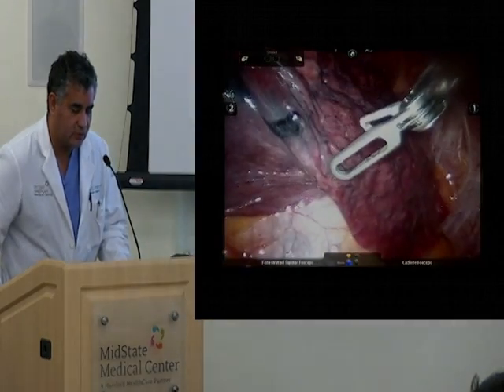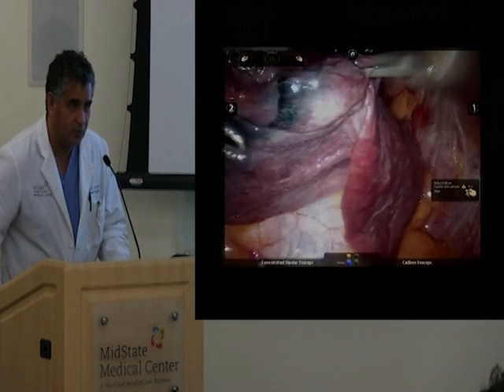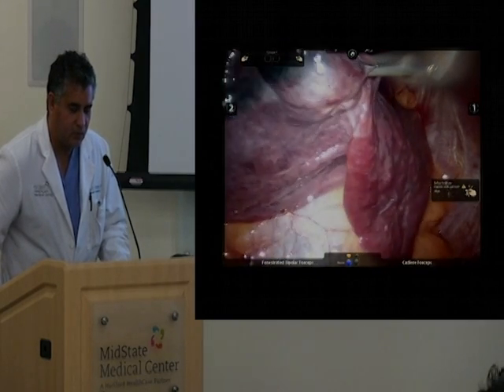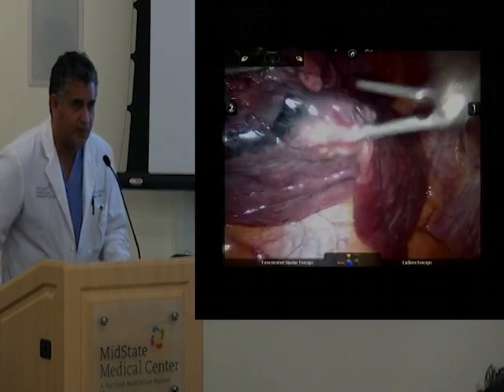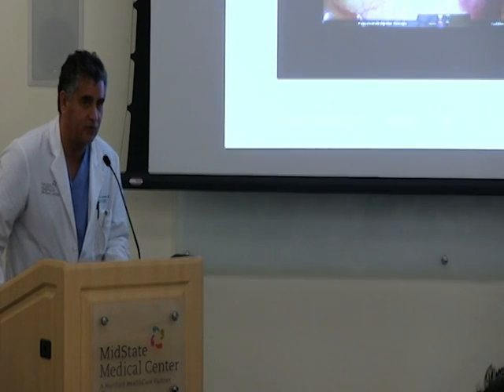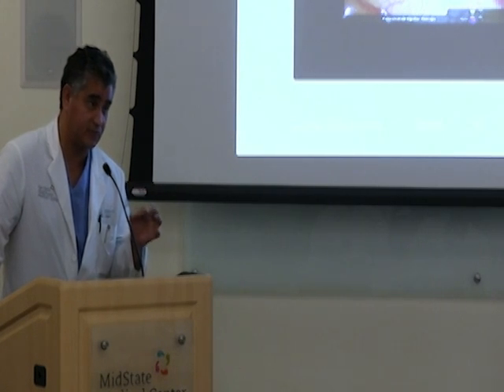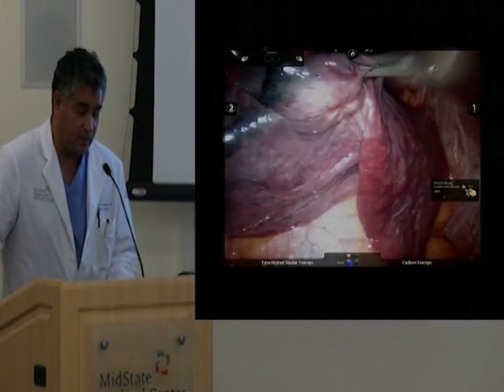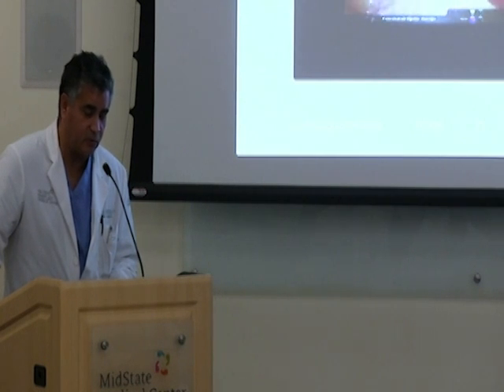And here you can see from the side, you see that blue dye, sort of like a blue brick road, that's leading out to what we're going to see here is this nodule, right? So obviously that would have been suspicious by vision, but we have no way of knowing ahead of time whether we're going to be lucky enough to see an indentation of the pleura. Sometimes we don't see it. And in that case, where this dye was would pretty much be our target for what we're going to resect. And you can see right here how it's starting to look ugly, right? And so we ultimately took that out. We did a wedge on her because of her pulmonary reserve.